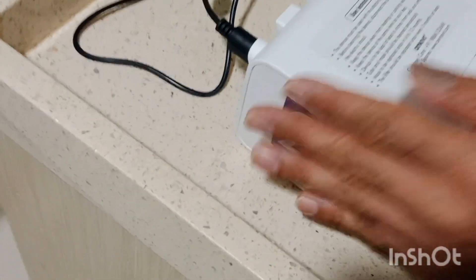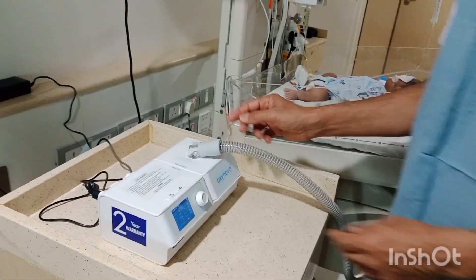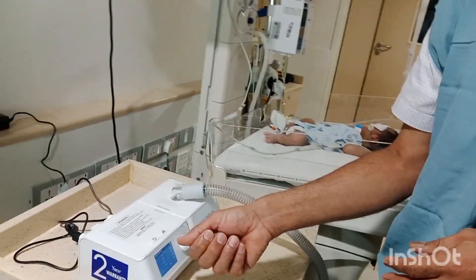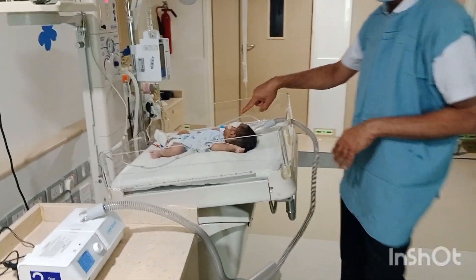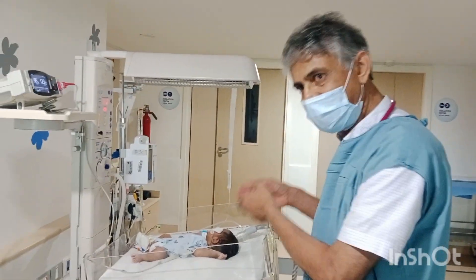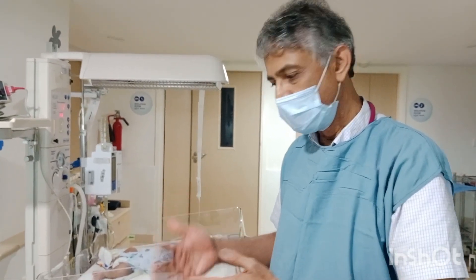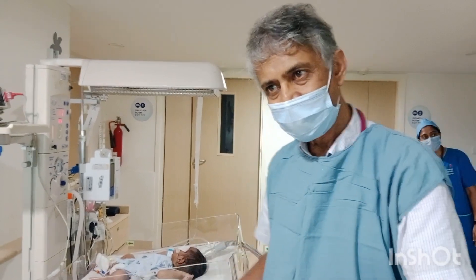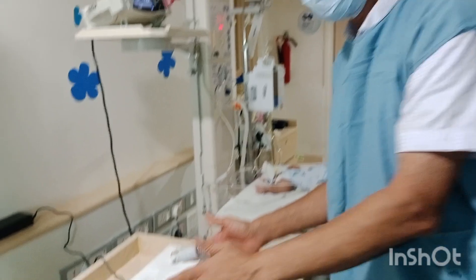Because it is a single self-contained unit, it is easy to handle and can easily be taught to the parents. We can teach them how to set up the instrument, and the interface is also easy to manage. Most babies who are in the NICU on CPAP for respiratory failure transition to this type of device, stay for some time, learn to use it, and are sent home on BiPAP.